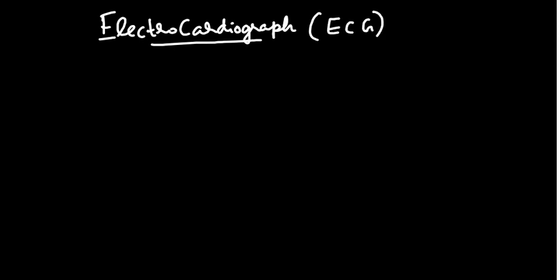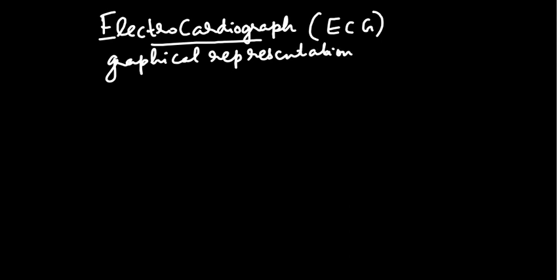Electrocardiograph. ECG is actually a graphical representation of the electrical activity of the heart.